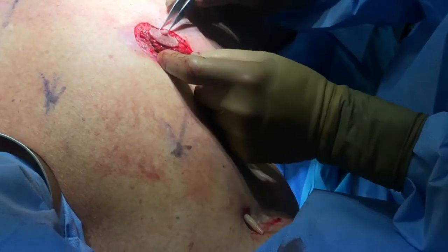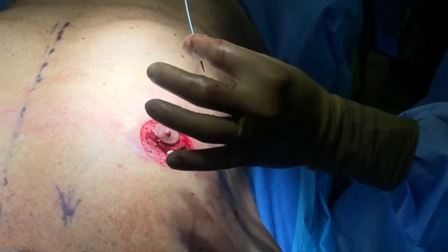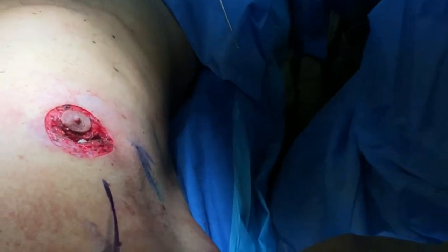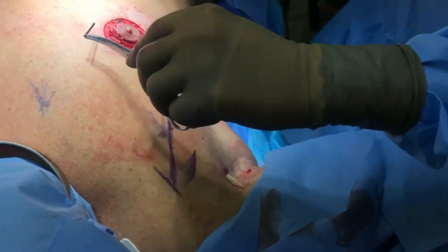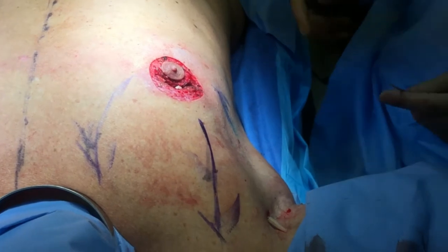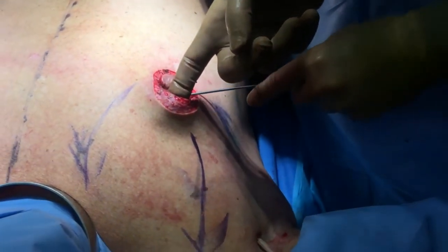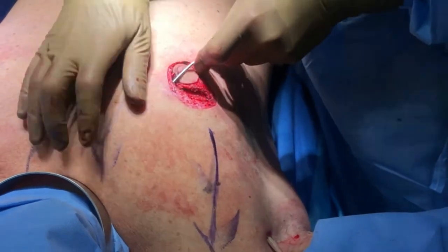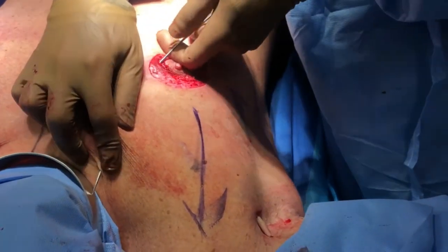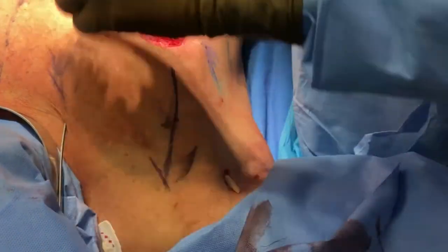I'm going to use two Vicryl sutures to re-approximate the tissues here. This is our needle for our hitch lift. These are our vectors for the hitch lift — here and here. We protect the neck for the dog collar. Now we're just going to sneak underneath here. There's the needle — all controlled. You need to stitch.